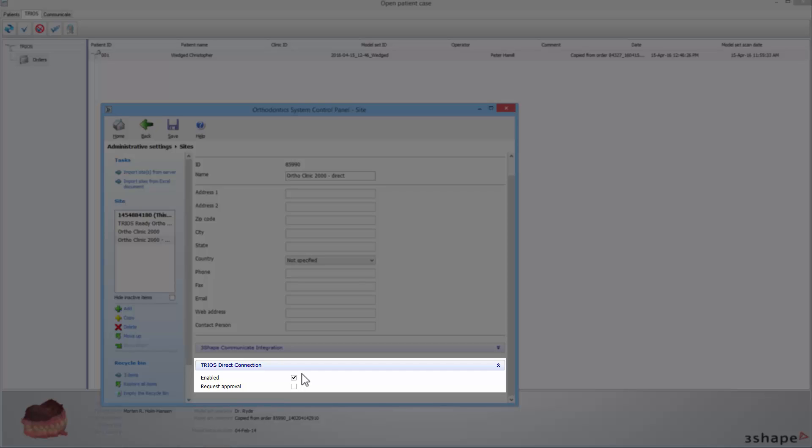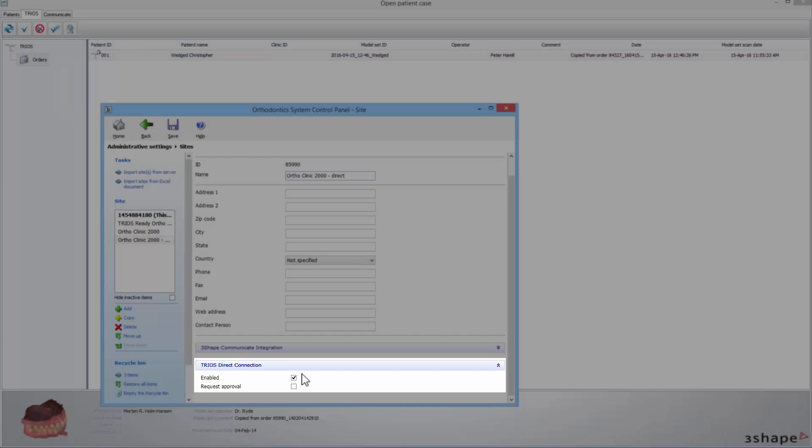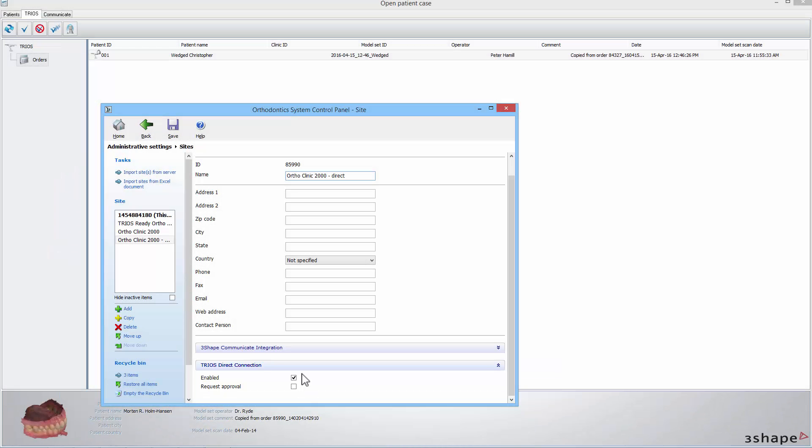The program always adds the previously non-existent sites to the list, automatically enables the corresponding communication integration, and gives the user a chance to edit the information regarding this site. When you finish editing the site data, click the Save button.